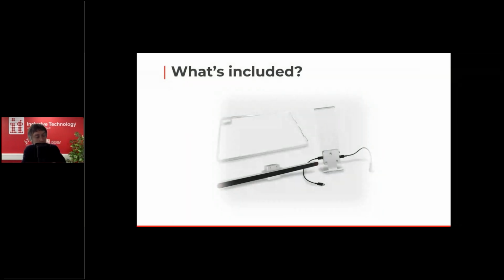As you can see, I'm going onto just the directional and moving across screens. That was an example where it reverted back to the mouse cursor, but then going back to the cells, it will automatically go onto Snap to Item mode. So that's what Snap to Item was about, for all of you who haven't come across that one before.